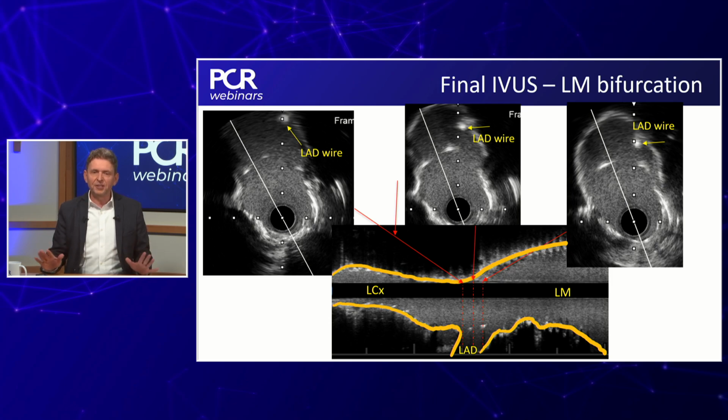And maybe this is my last slide. This again just delineated the circumflex, the takeoff of the LAD, and you can clearly see that there are some struts. Some floating struts. We can still discuss that later on.